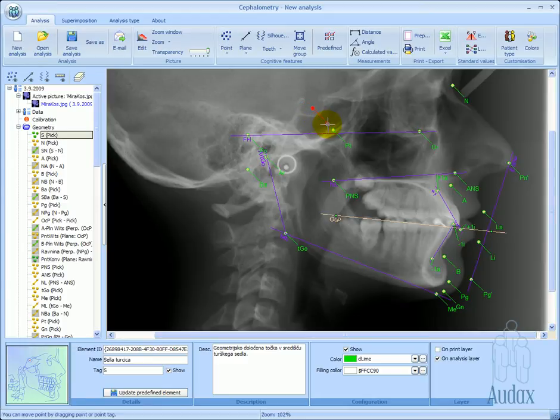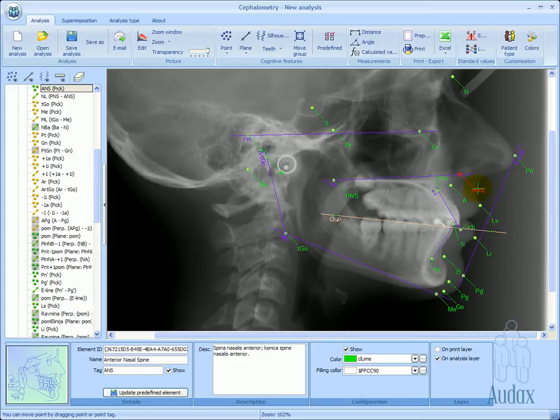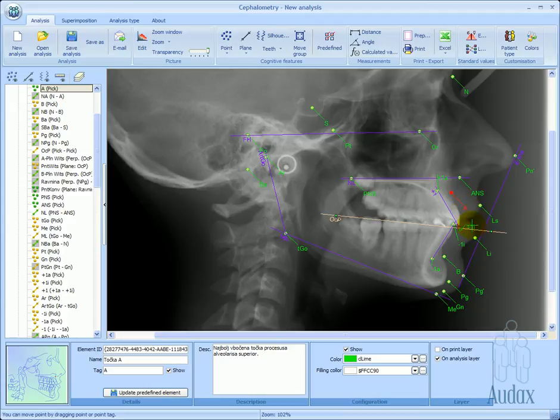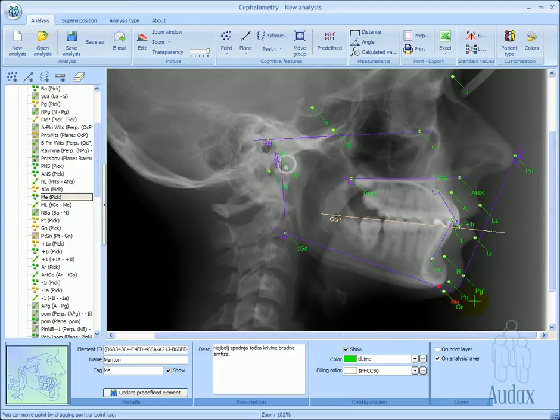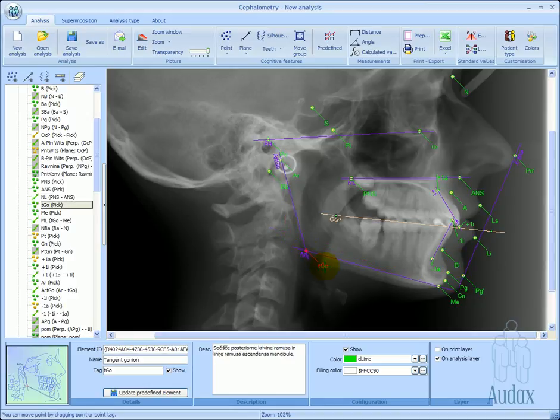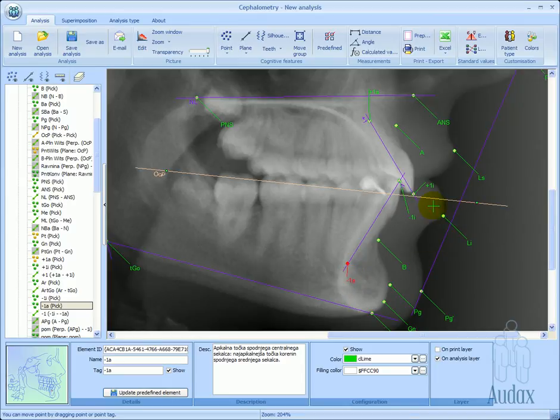Afterwards, we can fine-tune each point and plane's positions individually. The sella turcica, nasion, pronasale, soft tissue pogonion, labrale inferior, labrale superior, anterior nasal spine, posterior nasal spine, point A, and then the incisor edge of the upper incisor and the lower incisor. Moving the porion — it can be very challenging to define on the image. Articulare, basion, menton, pogonion, gnathion, point B, tangent gonion, and both incisor apexes.